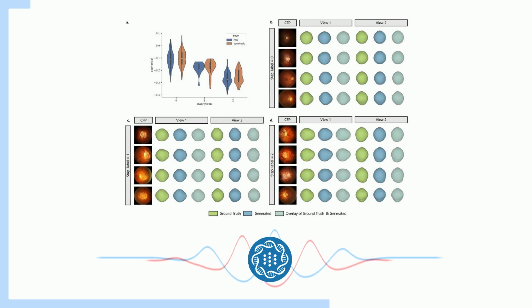That's incredible. But there was this term earlier that really caught my attention, counterfactual generation. It sounds a little mind-bending. Can you explain what that means? Why is it so important here? So counterfactual generation is essentially the ability to create what-if scenarios. Like, what if this eye had a different axial length, or the focusing power was different?